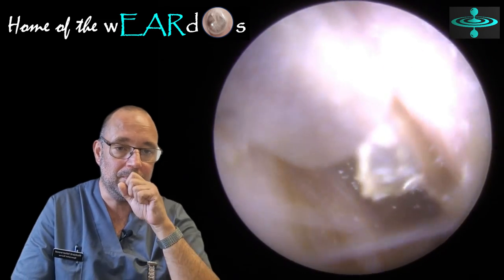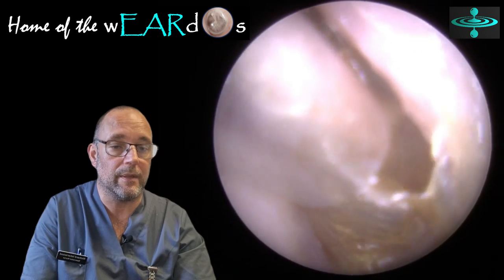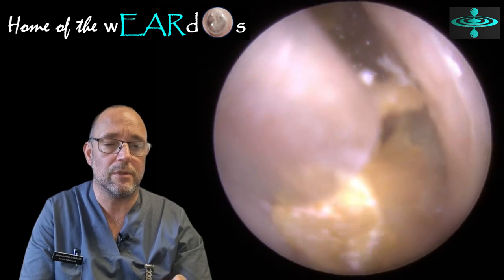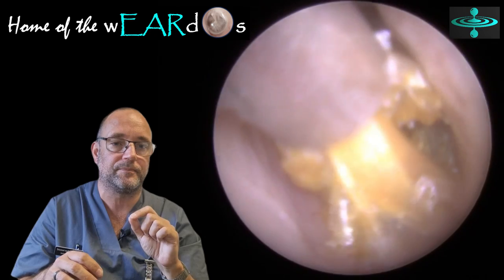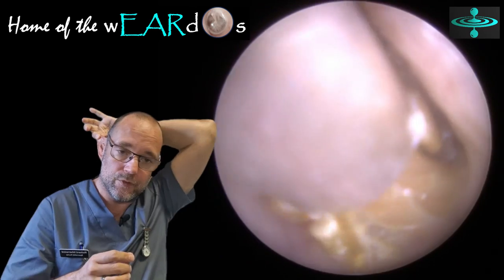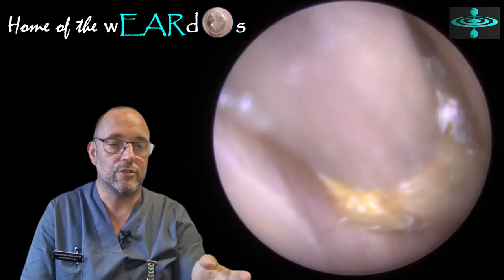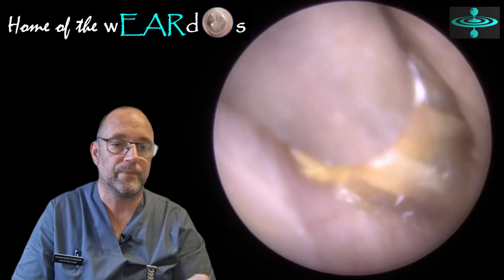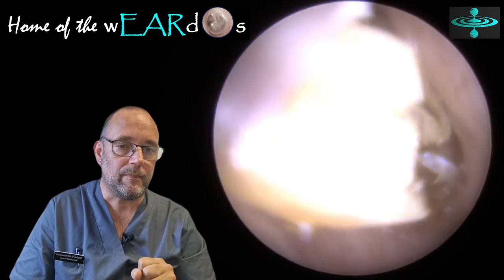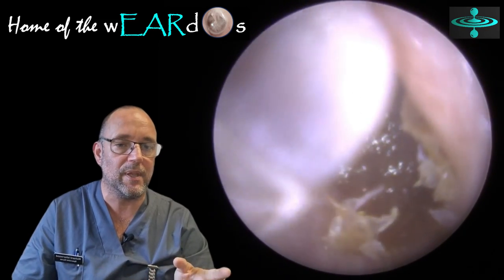Now this one — you can see how difficult it is. This sheet of skin has actually just jumped into the tube here. It might pull that darker section forward with it if I can grab all of that. Ones like this are really difficult. The patient's ear was so narrow there was no way I was able to fit the endoscope and the suction tube in at the same time unless I stretched his ear. So I ask him to grab the ear and pull it backwards to stretch it out and open it a little bit. It's still narrow, still very difficult. The suction tube is only two millimetres — the larger of the two — and there's not much room either side, so visibility is particularly difficult.